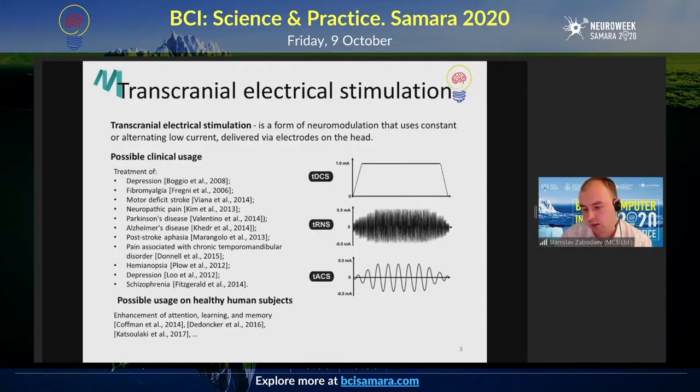Now we get back to electric stimulation. Here we use special electrodes, and you put on the current generator, which keeps this current on by regulating the voltage potential differential between two or several electrodes.